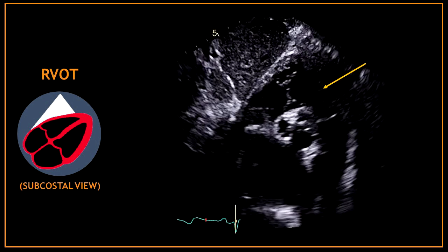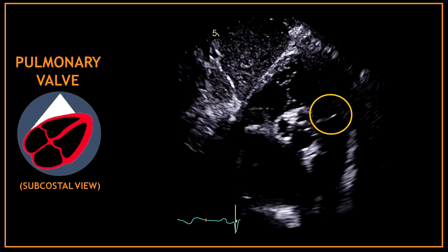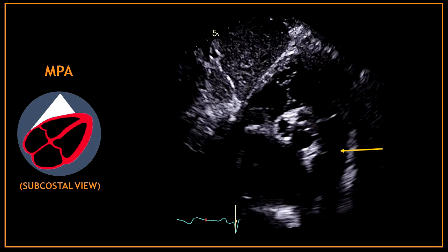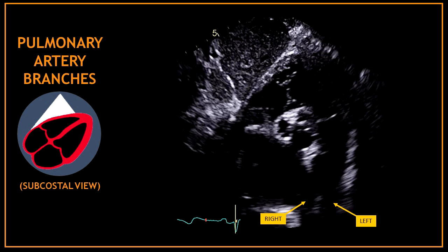Patients with COPD often have poor parasternal views, and the subcostal view gives you a great opportunity to assess all the short axis views, even at the great vessels level. This is a short axis view of the great vessels level obtained from the subcostal view. Here we can find the right ventricular outflow tract, the pulmonary valve, the main pulmonary artery, and often the right and left pulmonary artery branches.